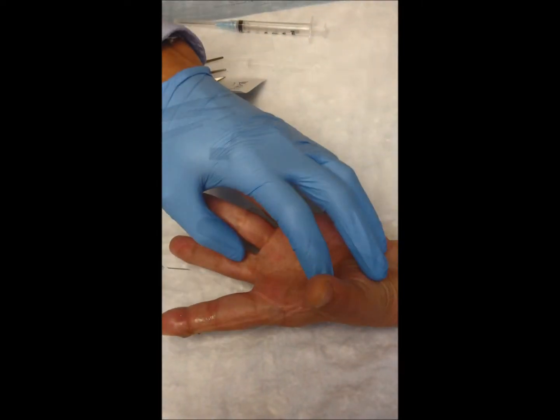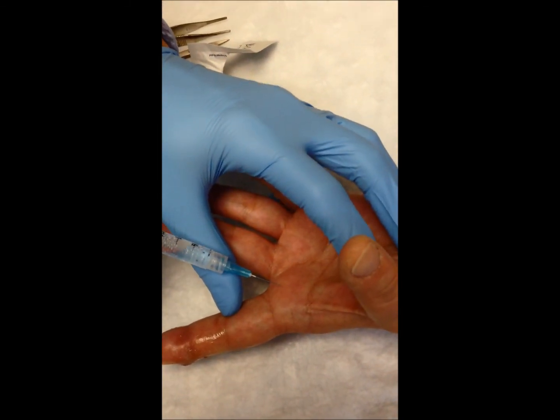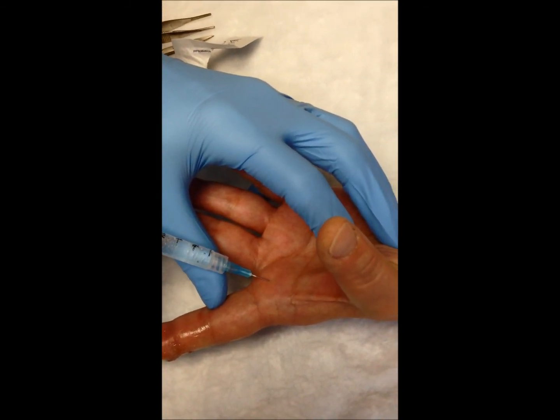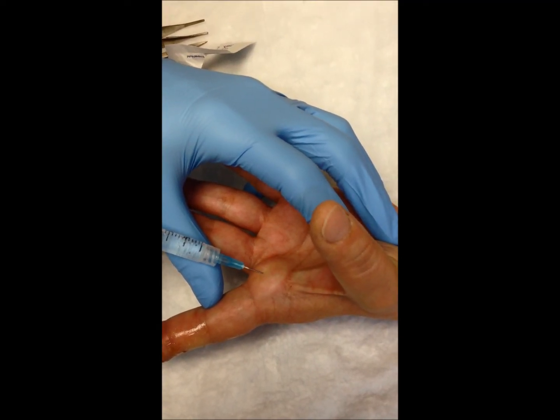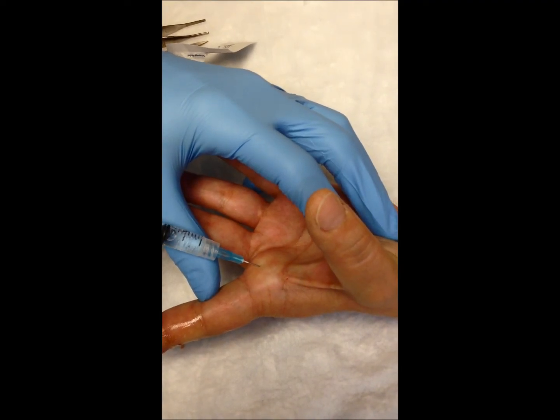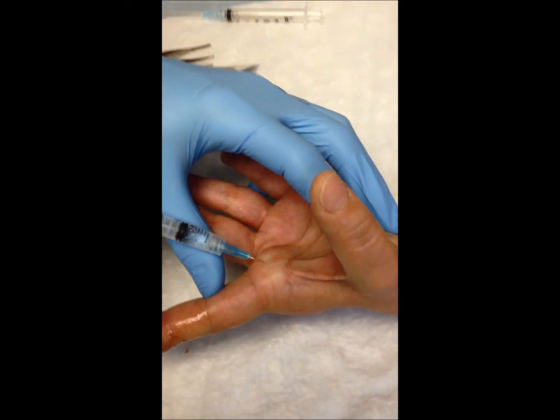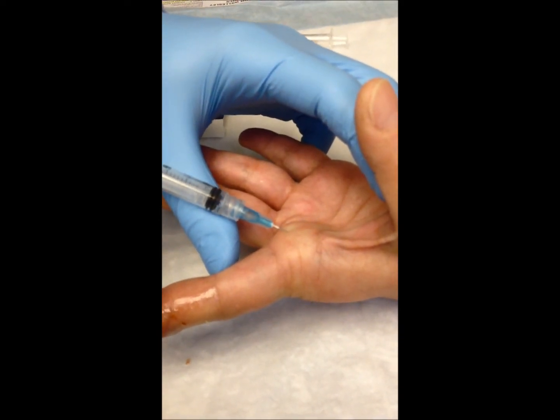This can be done with a single injection right in the midline of the finger as shown here. Once again, a quick, decisive stroke with a short, sharp 25 gauge needle is used to inject the exact same volume and type of anesthetic as on the dorsal surface of the finger, and this should complete the procedure. After another 5 minutes, the patient's finger should be completely numb.